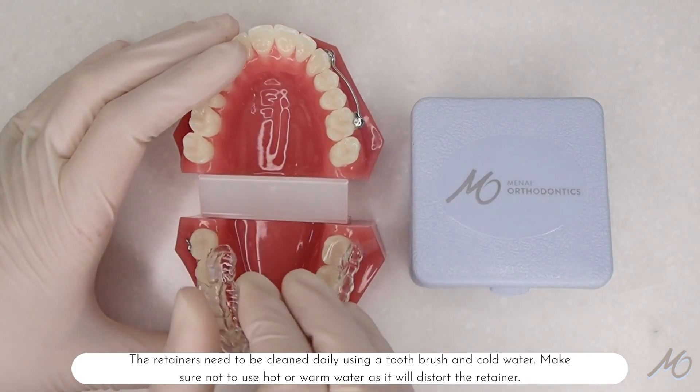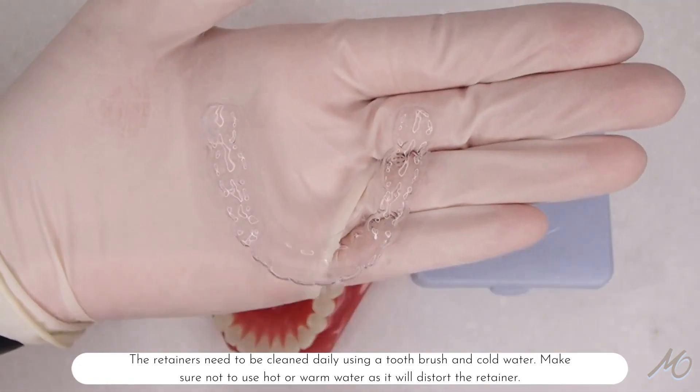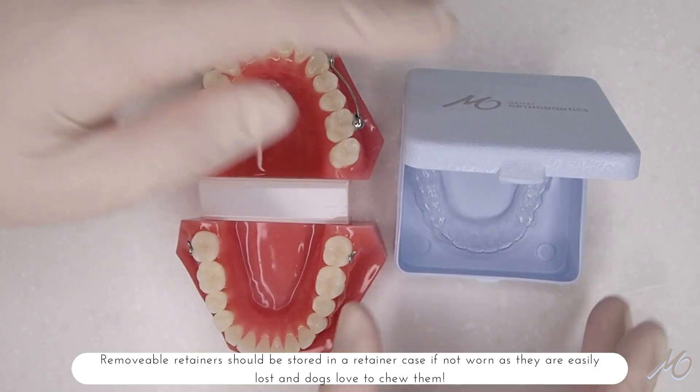The retainers need to be cleaned daily using a toothbrush in cold water. Make sure not to use hot water as it will distort the retainer. Removable retainers should be stored in a retainer case if not worn, as they are easily lost and dogs love to chew them.